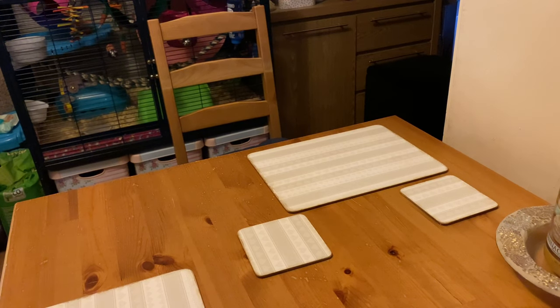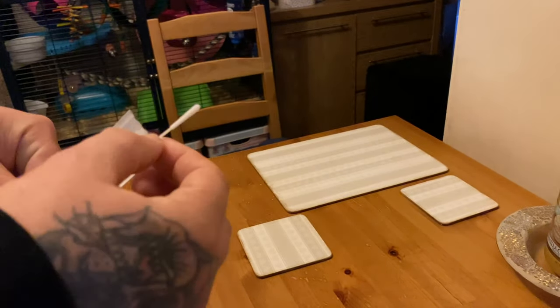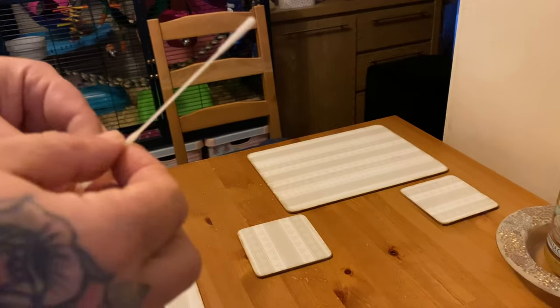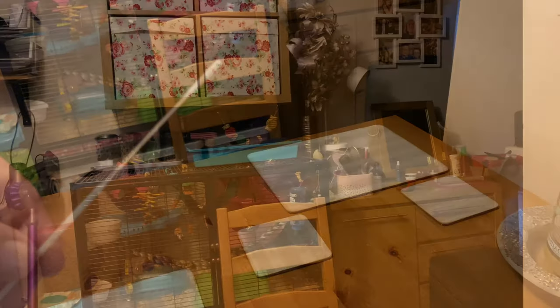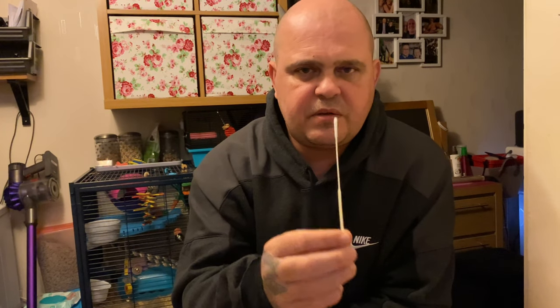This is the bit that might gross people out — this is where you stick it. Open this and take out your test. I'm just going to angle the camera to show you what to do with this. Once you've got the test — the cotton bud thing — you need to put it up your nose about an inch and then just scrape it around. Do it for about 10 to 20 seconds, give it a good scrape. Don't go too deep or you'll give yourself a nosebleed. Then do the other nostril and give that a scrape too.